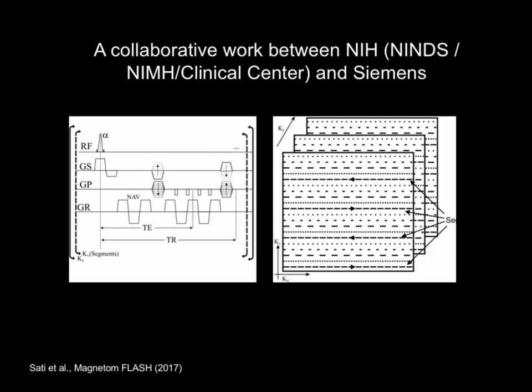In a nutshell, what it does is it's like a slow EPI, like the one you use in fMRI. If you've heard about the nuts and bolts of how to acquire an EPI sequence, basically you try to go through your k-space, or your MRI data, as quickly as possible. Typically it's done in a single shot, which gives you this high temporal resolution. What we're trying to do here is slow it down, because I don't need to scan my patient in a few seconds. What I need is a good anatomical image. If you go too fast, usually you have too much artifact.